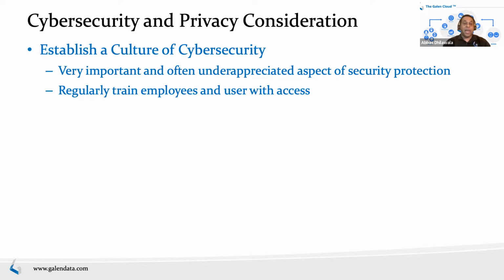Define within the company itself how you would provide access to different people, with different data, so that they can do their job, but do it in a way that is secure. For example, if you have customer support that needs access to patient data to help with the device, obviously they need that access for their job, but how do you limit that to only those people, or how do you train them in a different way? How do you control access so that they can only access from certain points within your organization, or with certain extra access or stuff like that? So setting up proper access control and reviewing those access controls regularly is very important.